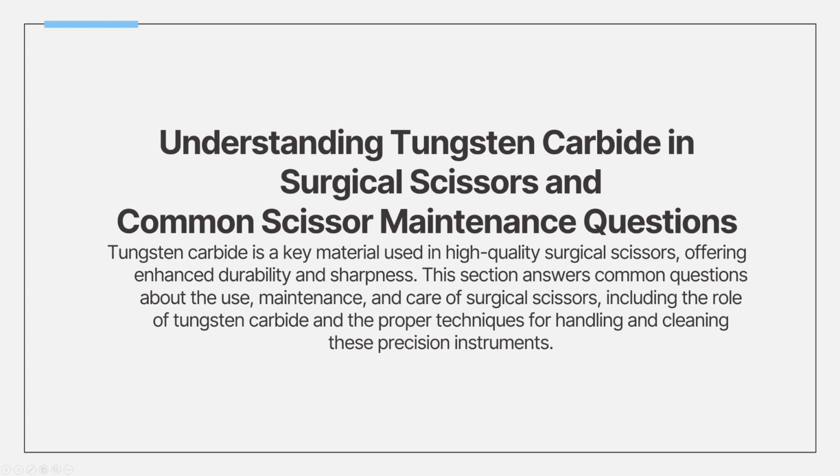And now we're going to try to understand tungsten carbide in surgical scissors and any other common maintenance questions for it. Furthermore, tungsten carbide enhances the durability and sharpness of surgical scissors.